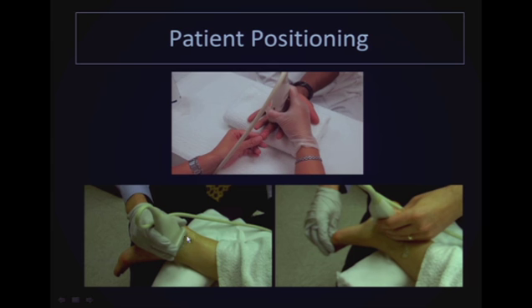For the ankle, it's easier to follow the medial and the lateral tendons when the patient is prone and the foot is off the edge of the bed. And we can also perform a dynamic maneuver, or dorsiflex or plantar flex the foot if it is extending off the table.